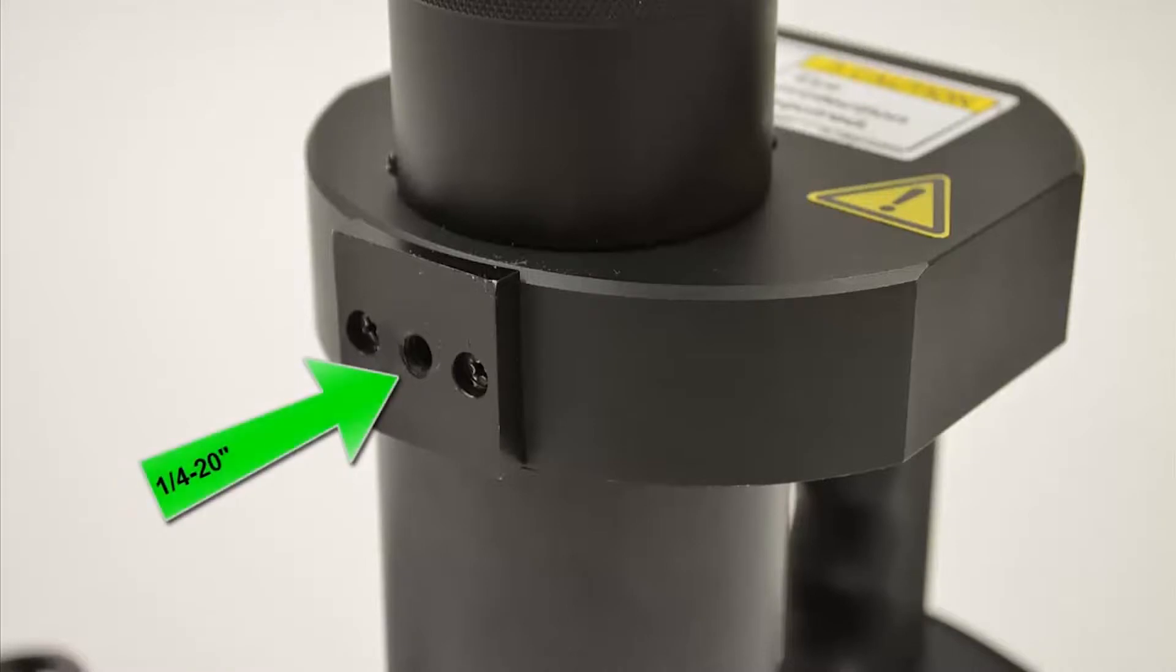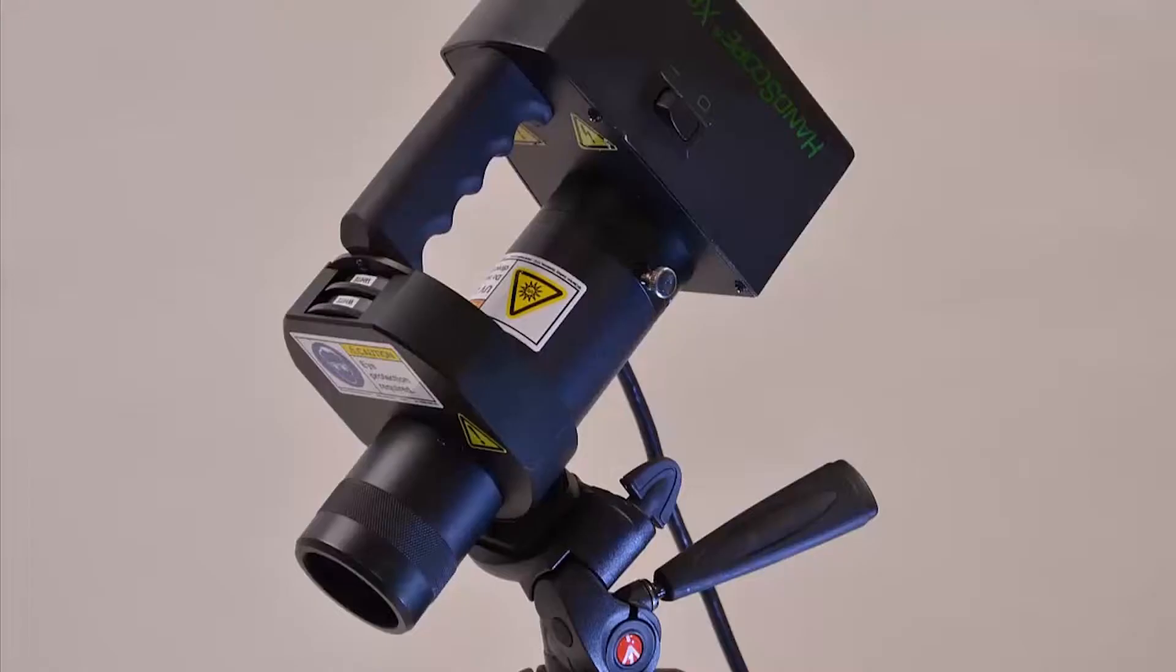Also a 1-4-20 thread mount so the handscope can be easily attached to a tripod.